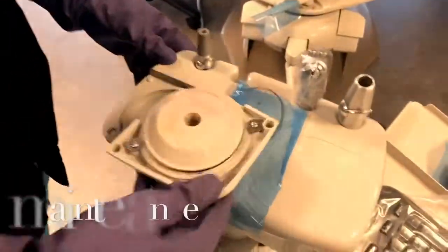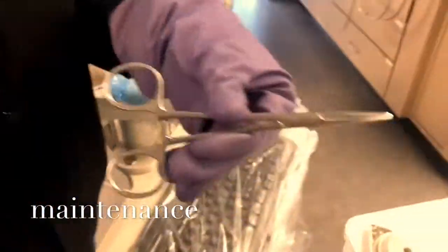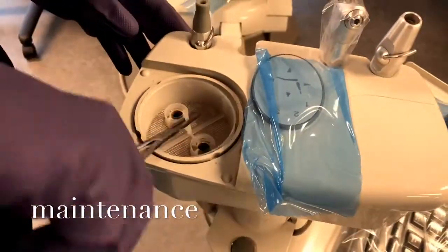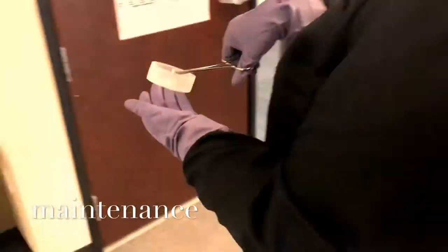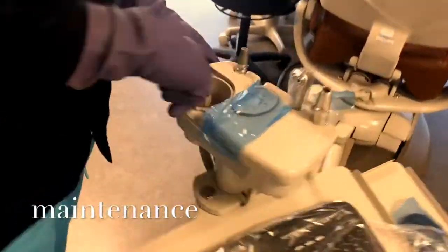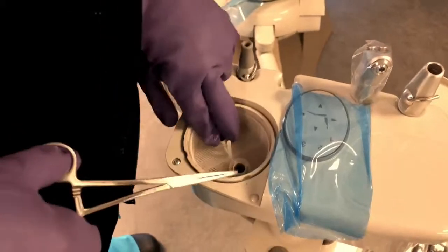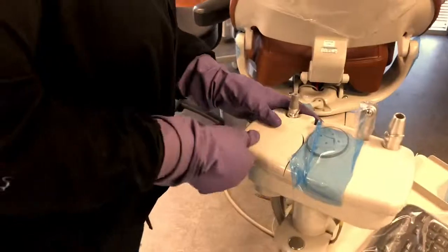While the lines are being flushed, we're going to go ahead and exchange our trap. She gets her hemostats and she's going to remove it and throw it away into the trash. As you can see, she is also wearing her utility gloves and her PPE. She's going to go ahead and spray it down with Cavicide and brush it so it can be clean. Just taking away all that dirty excess. Here we're using our hemostat to place in a new trap and making sure that everything's clean and ready for a new day.